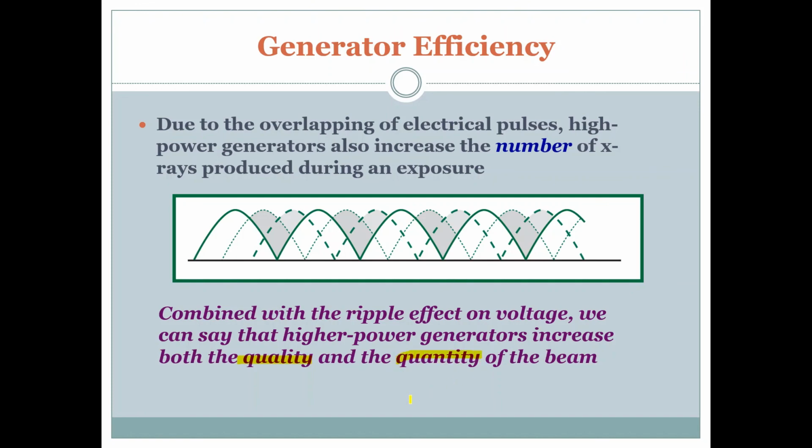So we can make more X-rays, we can make more energetic X-rays more efficiently. More of them are higher energy than our lower energy, so we increase the average energy of the beam, which increases the overall penetration of the beam, and all of that comes together to produce better images with less exposure for our patients. This concludes my talk on X-ray production and target interactions.